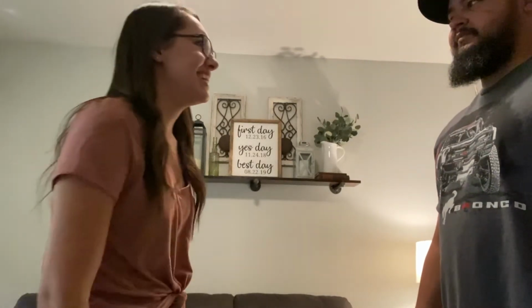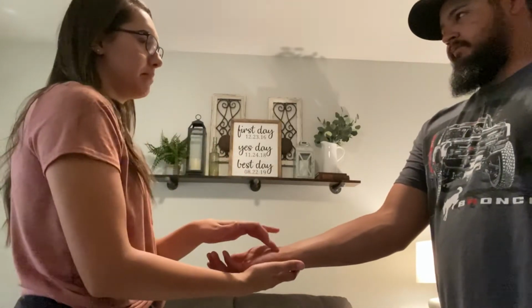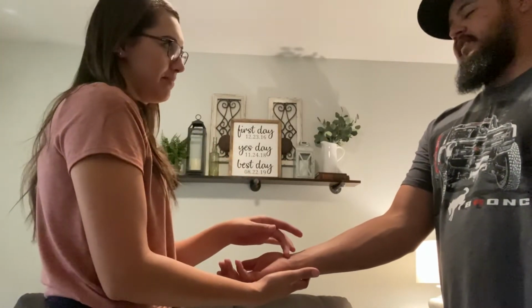Hi, I'm Brianna. I'm going to take a couple x-rays of you today. Can I verify your name and date of birth? What's your name? Jared Brewer. What's your date of birth? 12/10/93. Any chance of pregnancy? No. Okay. Have you put on a robe? And if you have any jewelry or socks or shoes, please remove them. Sounds good. Okay. You can lay down here.